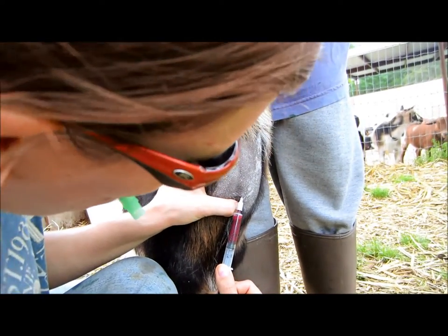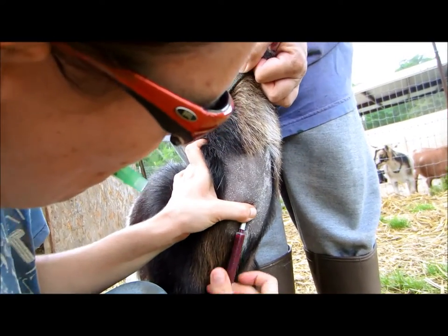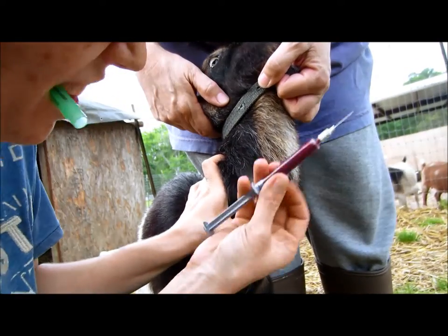Sometimes you'll lose the vein and that's fine — don't fret, don't worry. Shift it just a little and you'll get it back. And that's all it takes.